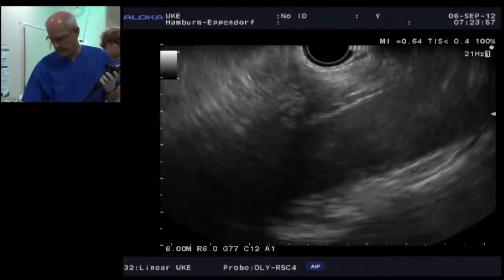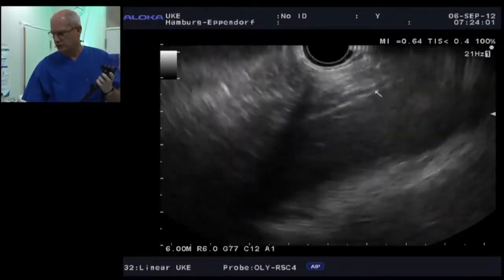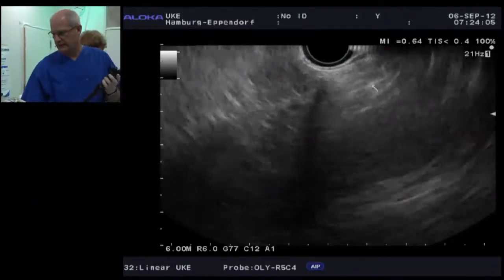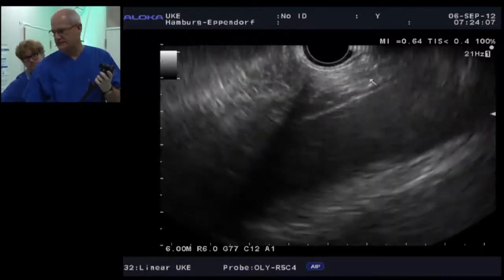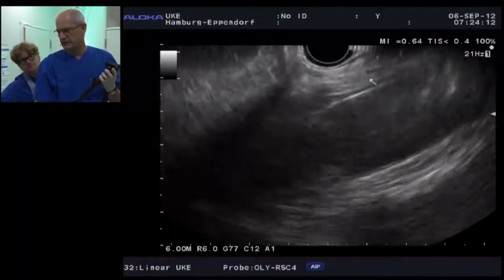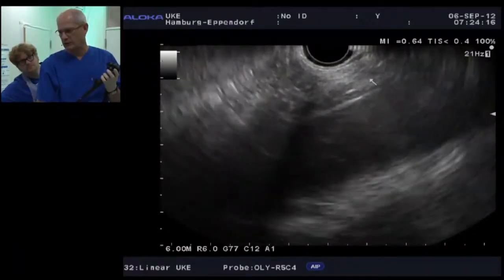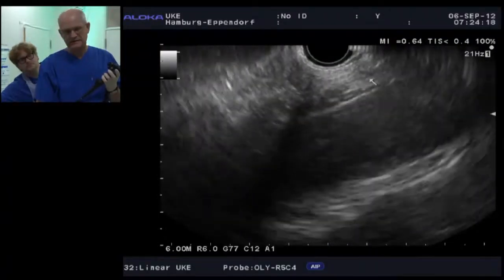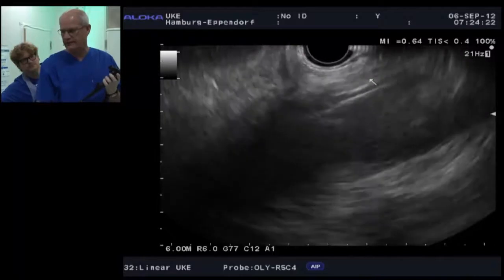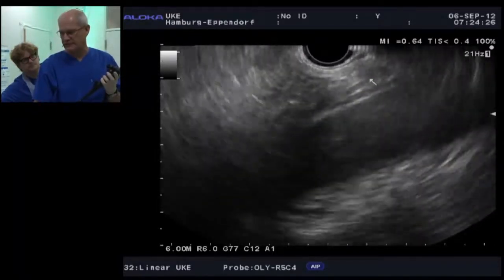Now, what I also like to have you do is to keep an eye on the crura of the diaphragm. The reason I like to emphasize that is because when the crura disappears, then the celiac artery will take off almost immediately. And sometimes if the celiac artery takes off of the side of the aorta, if you're not cognizant of where it comes off, you'll miss it.